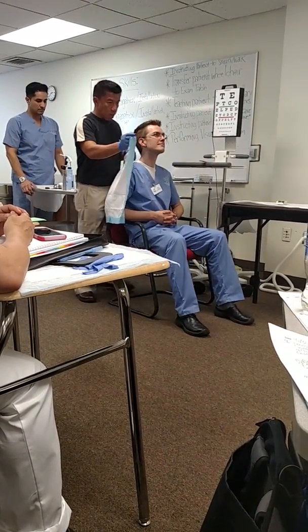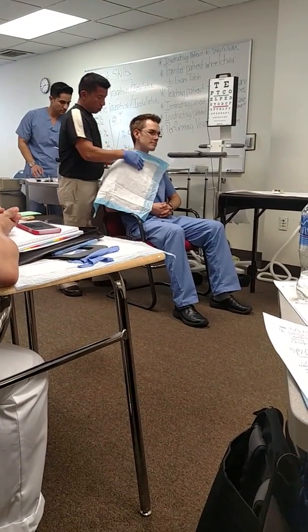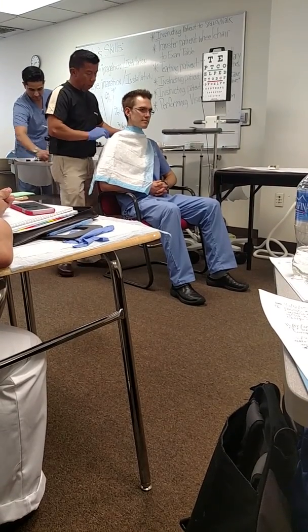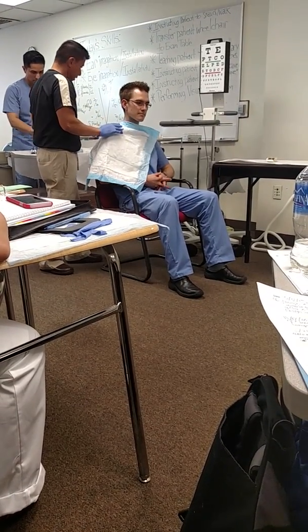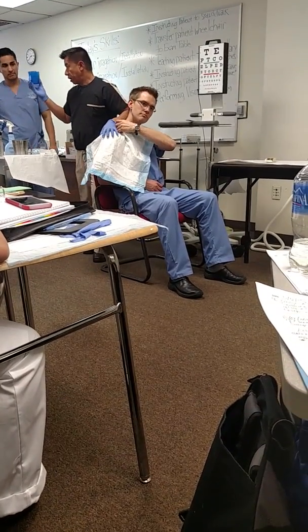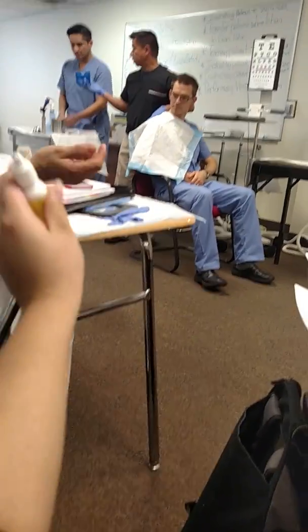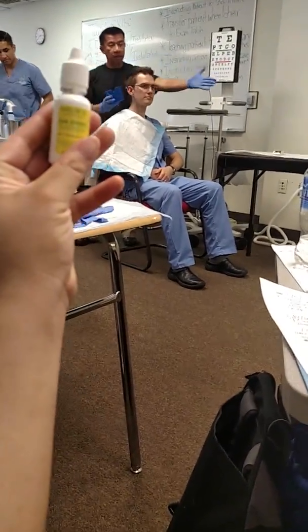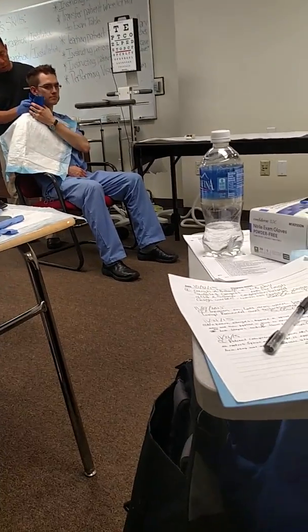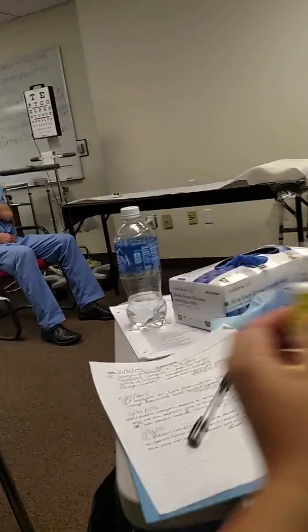Alrighty. So what you need is the towel or anything that you use in the clinic to protect the patient from getting wet. I'm going to hold you here. You can do either sitting up or laying down. So I'm showing the sitting up so that everybody can see. Now, if it is laying down, it's the same procedure. Can you see this? Okay, Eric, there you go. Hold this for me. That will catch the excess fluid.